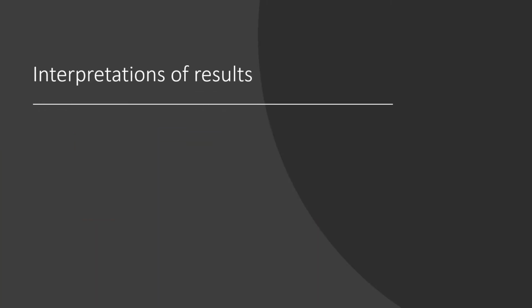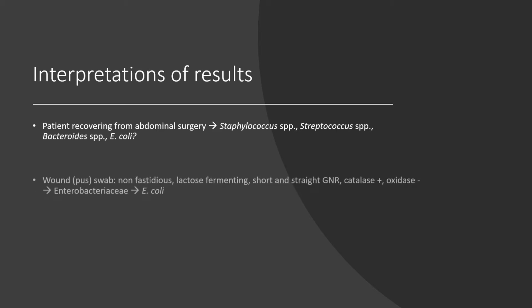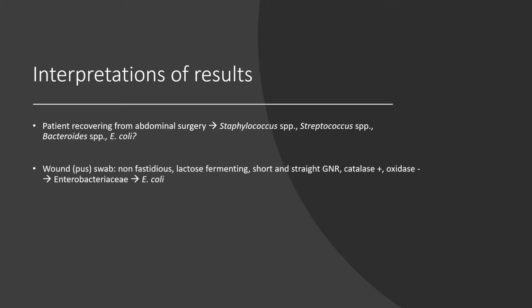We first began looking at the clinical notes of the patient to try and determine which pathogen may have caused the growth of pus on the surgery wound. It was suspected that a Staphylococcus species, Streptococcus species, or E. coli may have caused this infection, as they are the most common causes of infection post-operation. However, the surgery was performed in the abdomen, so we also suspected Bacteroides species to possibly be present, as it is often found in co-infections with facultative anaerobes after intestinal surgeries. So due to these facts, the media we set up on day 0 support the requirements to grow our suspected pathogen of the wound swab we received.